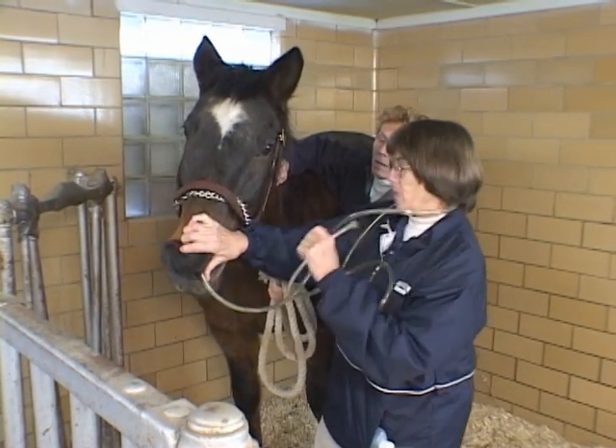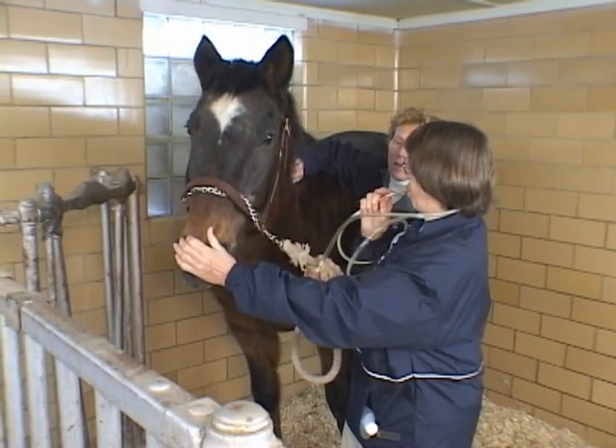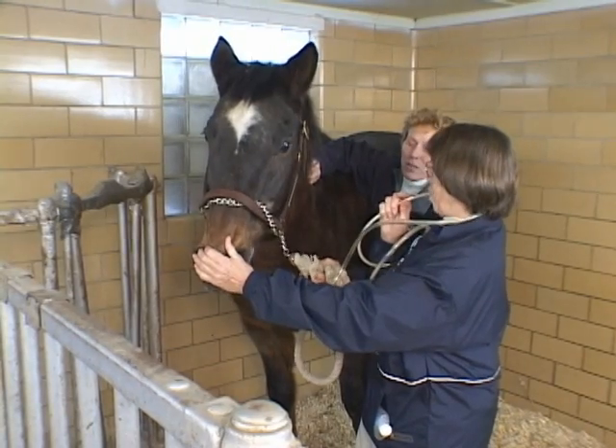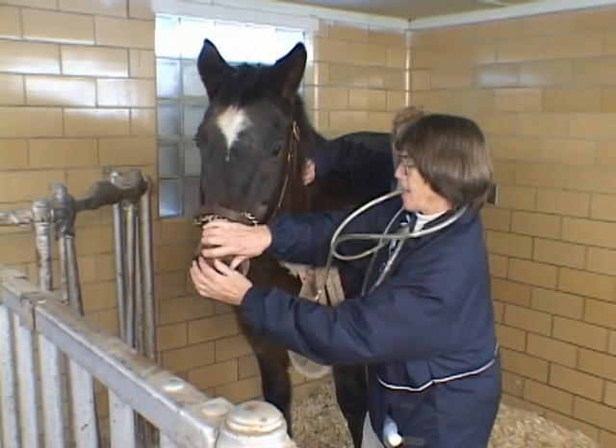Sometimes on the left-hand side you can see the tube passing in the esophagus, and she's watching for that. We joke around about how you could see it, you can hear it, and you can smell it — because when you get down to the stomach you can get the gas coming back from their stomach.